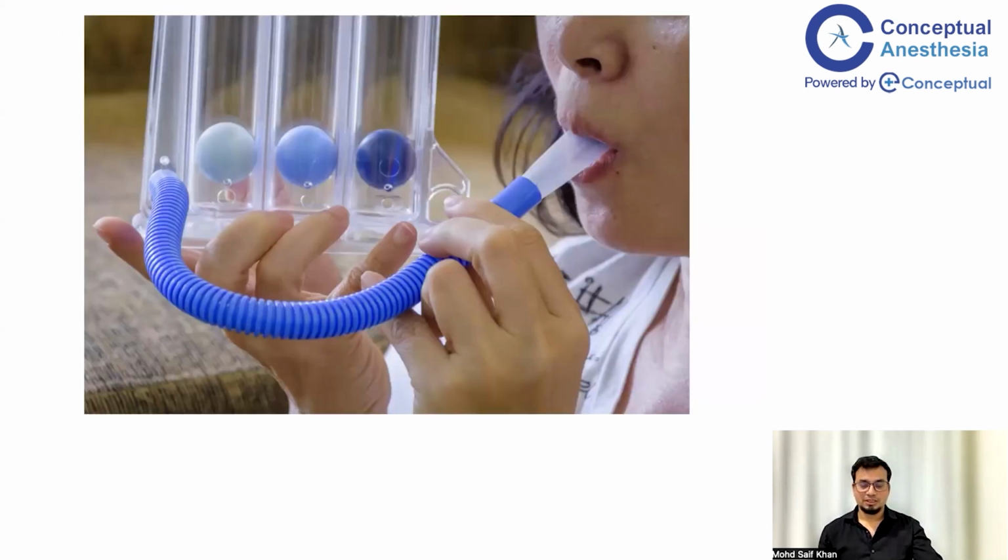Now, can you tell me what this is? This is also a spirometry, but a different kind of spirometry, and that is incentive spirometry. Incentive means positive feedback. This spirometry is used by the physiotherapist, especially the respiratory physiotherapist, and this is a handheld medical device.